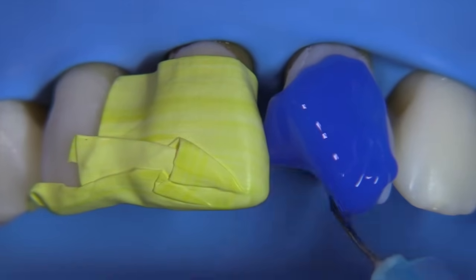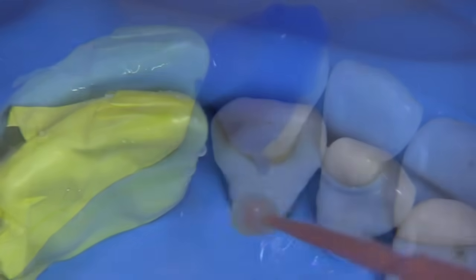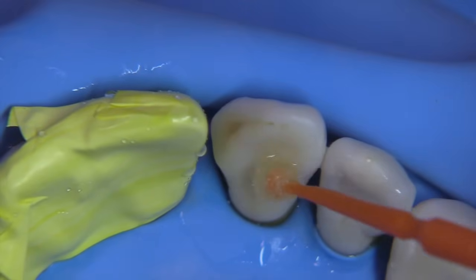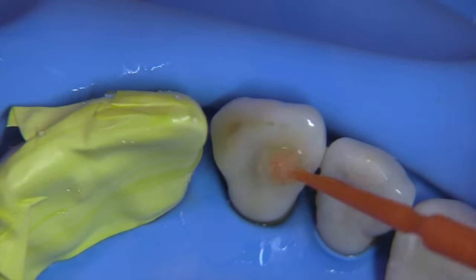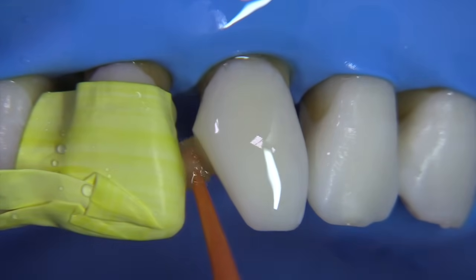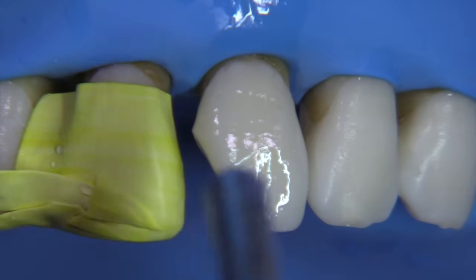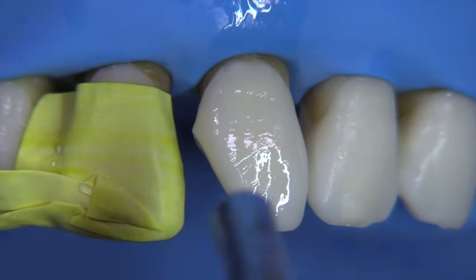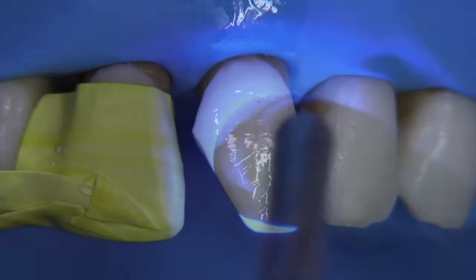Here we are putting acid etch over everything. We really like to extend the composite way beyond the bevel so that if there's any flash of composite, we're not going to have any white lines. We're going to use our adhesive system — I'm using a one-step universal adhesive system — and we're going to blow that thin. Look at all the texture on that tooth. We're going to light cure from the facial and light cure from the lingual as we always do.